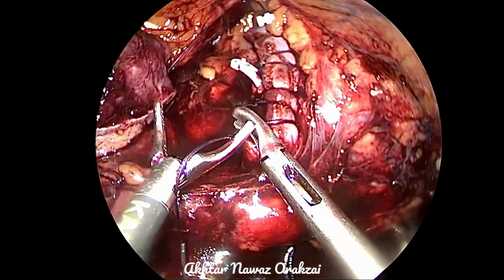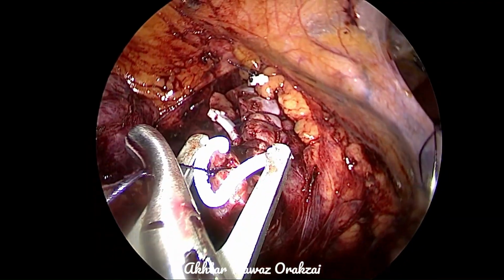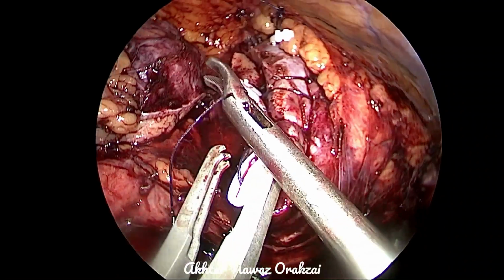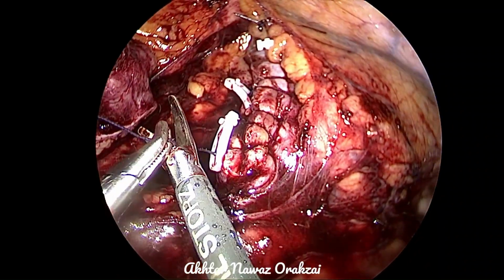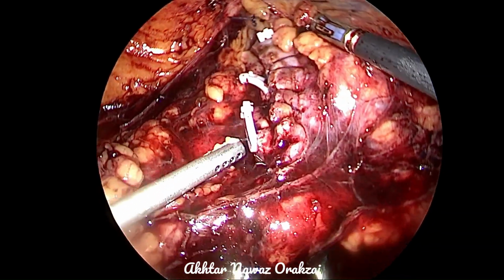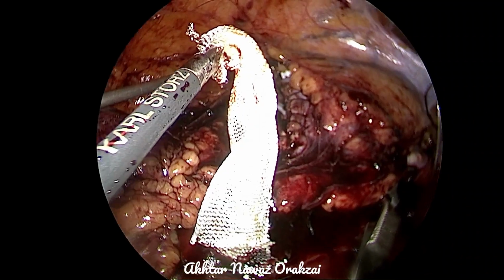So that suture sample needs to be used somewhere else. For example, I have a patient on the list for vesicovaginal fistula repair, so I prefer to use it there instead of repairing this small defect.